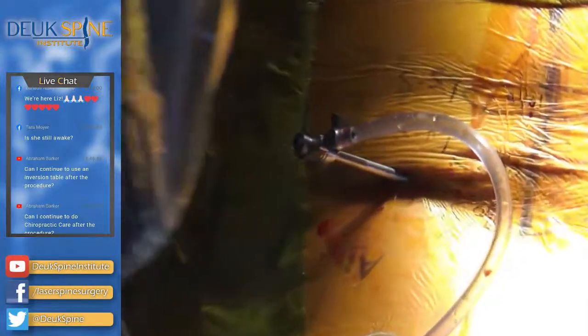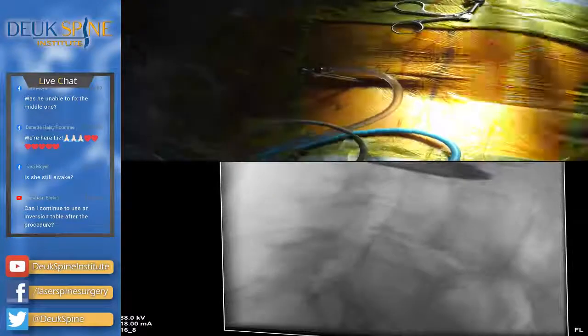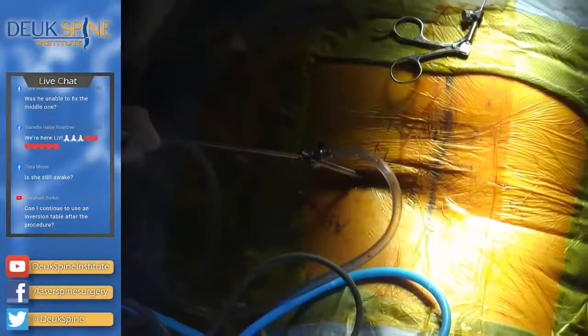All right, let's get the fluoro out, and move that sucker out completely. So we're done with using the x-ray machine to navigate, because we've used it for the last time to place our endoscopic tubular retractor into the L3-4 disc on the patient's right side. We know this disc is an 8 out of 10 in terms of the pain it produced on the discogram.